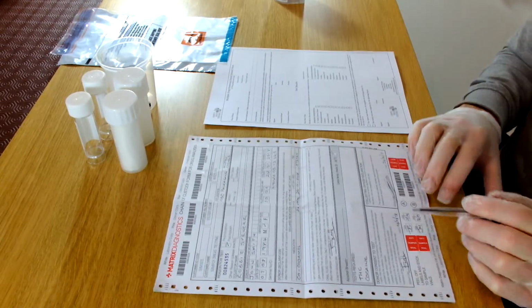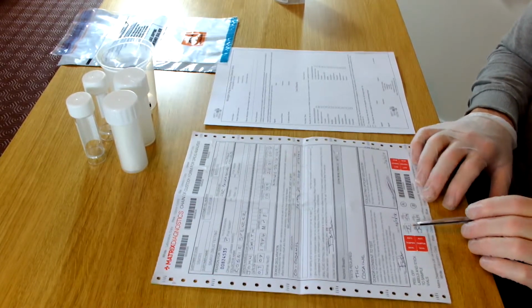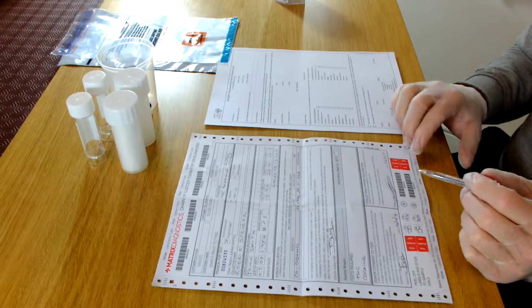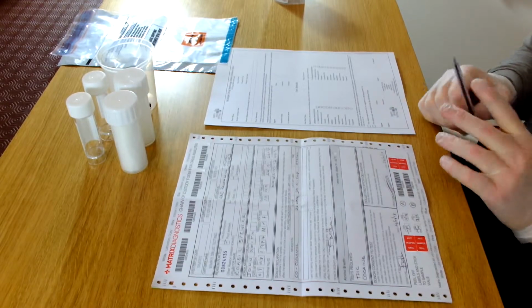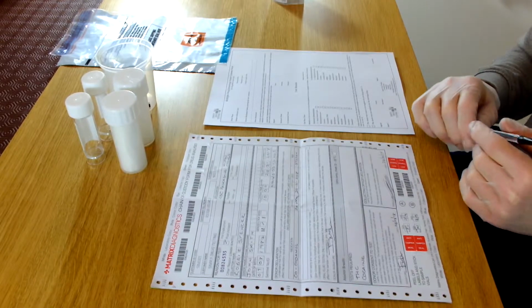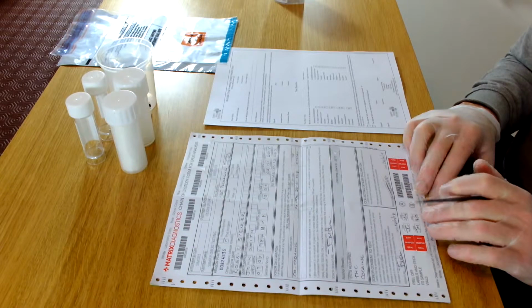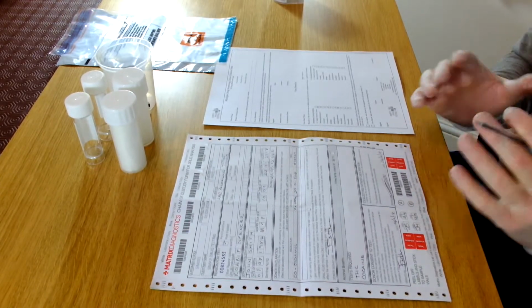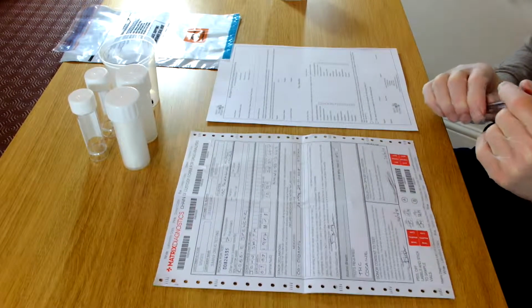The other important thing we need to do here is at the bottom we have two tamper-proof evidence seals, and we get the donor to sign each of the two seals and put the dates in there. The collecting officer could sign and date the two tamper-proof evidence seals. However, the donor could simply come back into the testing room at a later stage and say that because they hadn't signed it, you could have opened the pots and put new seals on, so it's in your best interest to make sure that the donor signs both of the seals and dates them. And that's how to complete a chain of custody form for drug analysis.